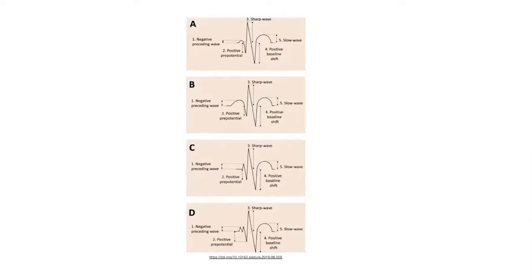And this is another part we're going to get back to as we're looking at EEG, that the EEG is something that's used in the context of a patient. And the diagnosis ultimately is the synthesis of what one sees on the EEG to what is happening before your eyes for the patient.